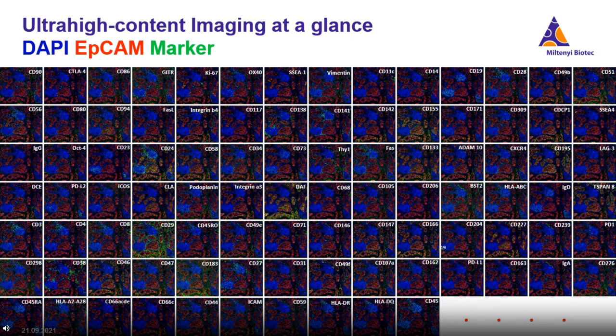The marker specific name is written in white on each image, and here they initially tested 97 markers, but unfortunately 4 markers did not show any signal. And I think we can appreciate how much valuable data we can obtain using this technology.